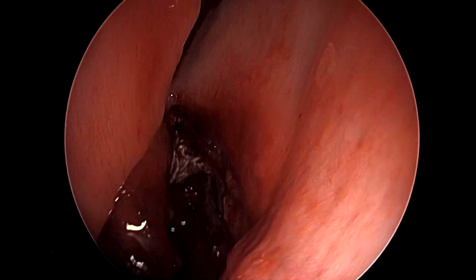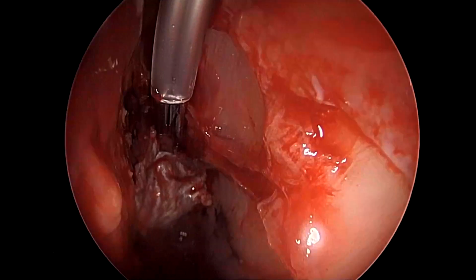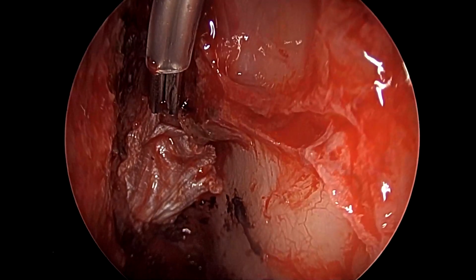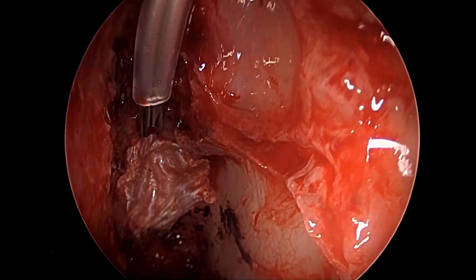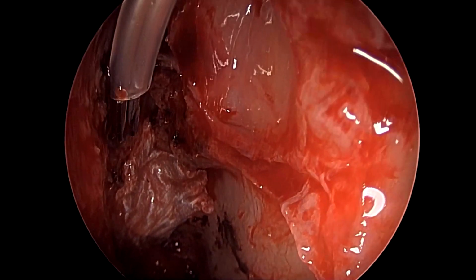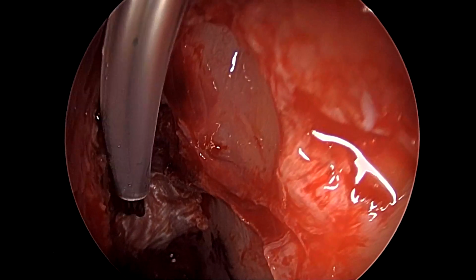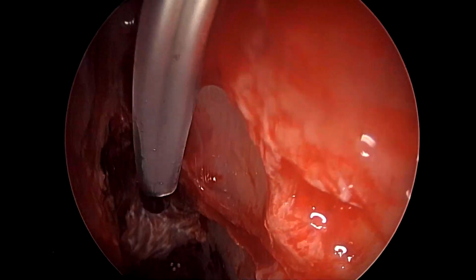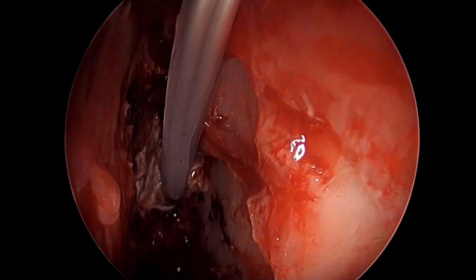It's also very important to not use any glue between these two fascia grafts. Here we're using tissue glue, but this tissue glue is used on the final layer always, and not in between the layers, because if we use it in between the layers, these layers will not get adequately adhered to each other, and then our purpose of reconstruction is lost.